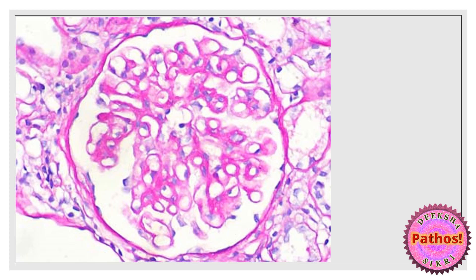Remember, periodic acid-Schiff stain gives you a nice rose-pink or magenta color. What you see is a background of pink with something a little brighter pink highlighted on it. All the basement membranes come PAS-positive: Bowman's capsule, the mesangium, the capillary basement membrane, and even the tubular basement membrane. So when I want to assess the mesangium or capillary basement membrane, I can use a PAS stain.